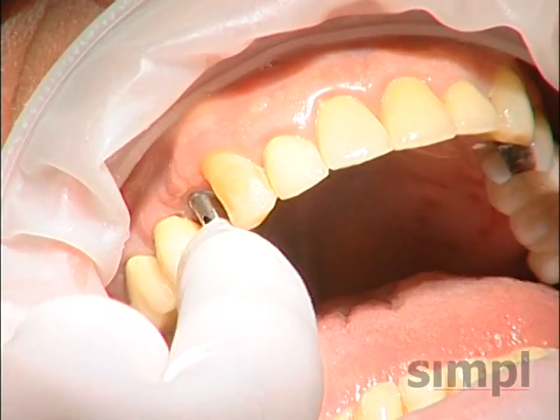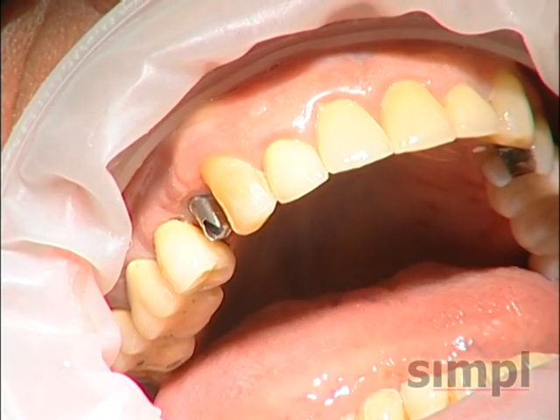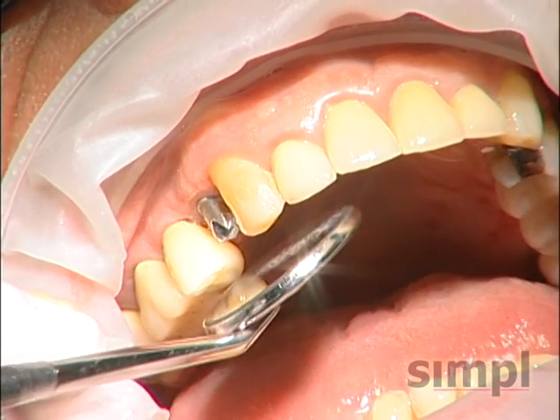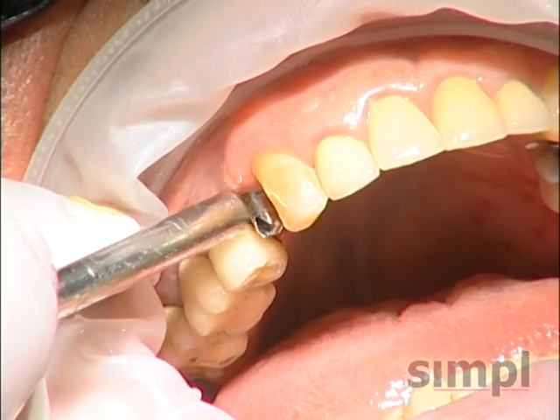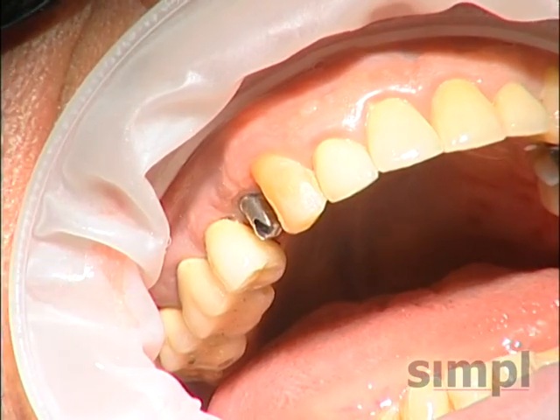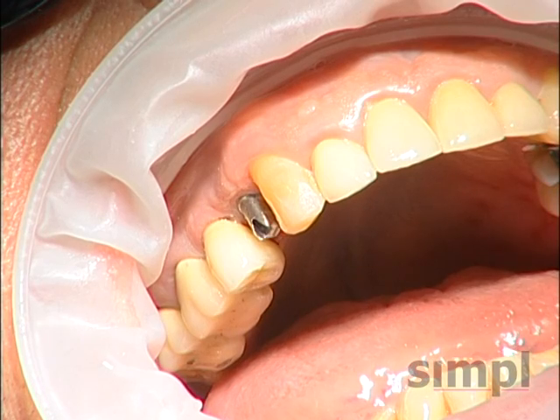We take it off. We see that the abutment is anatomically correct. This one is made out of titanium. We're going to check to see how it's fitting. And it looks like it's in the right position. Also, we can notice that number 5 is marked in the buccal. But this abutment can only fit one way, because it's anatomically correct, it follows the soft tissue margins.